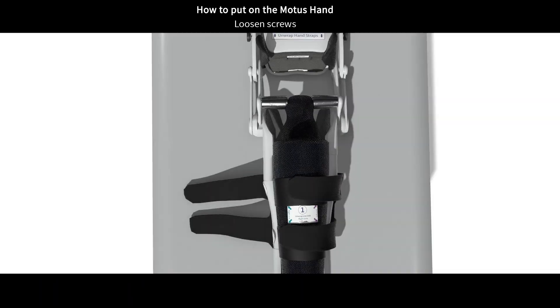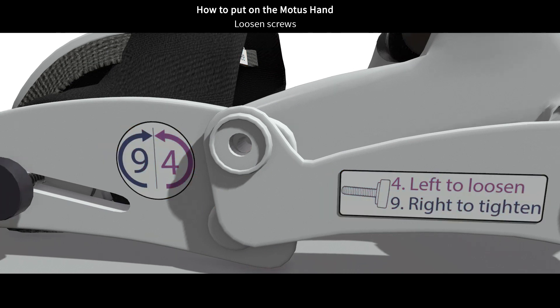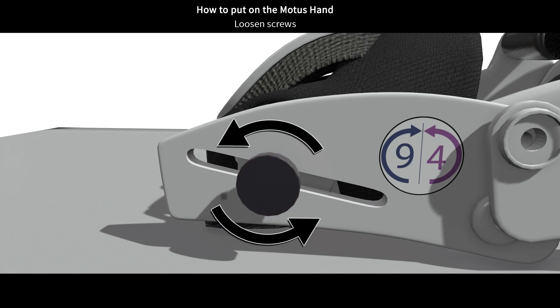Find the step 4 and 9 sticker, located on the left side of the hand linkages. Now, we will loosen the screw by turning it 3 turns counterclockwise, like this. Be sure to not fully unscrew the screw, just loosen it.